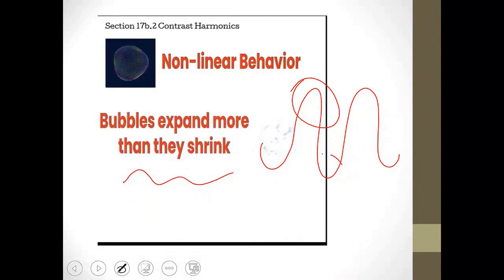Upon the release of pressure in this specific area, the microbubbles begin to move away from each other. This movement generates the signals that are subsequently received and utilized for imaging purposes. This concept is analogous to harmonic imaging. It involves inducing movement in regions where there are substantial microbubbles, thereby enhancing the reflected signal emanating from those regions due to the oscillation of their movement, which ultimately results in a distinct ultrasound pulse.